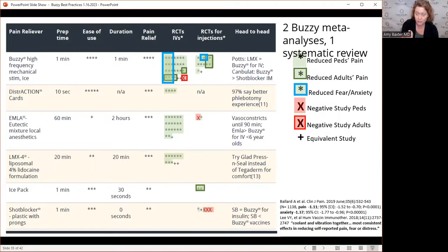So Synagis, if you're getting Rocephin, IM, the babies are able to remember enough that it causes increased duration of crying the 2nd and 3rd day they're getting a shot. So in that situation, they may not like the ice as much, but it is going to be better, and they'll have less of a bad reaction in terms of how long they scream than not using the ice.